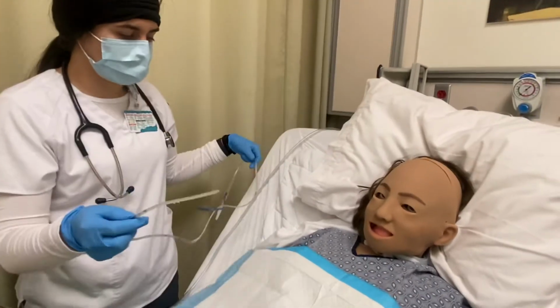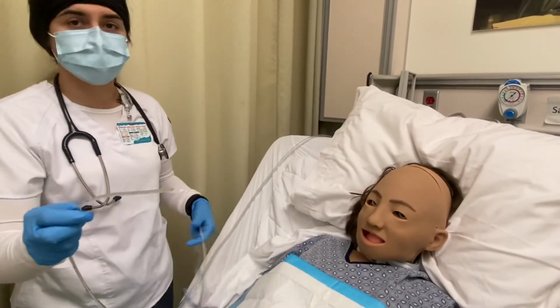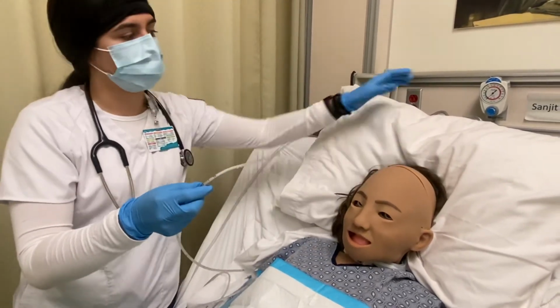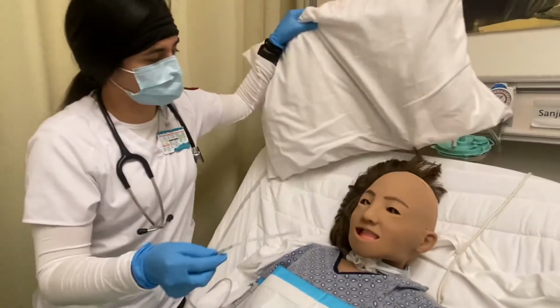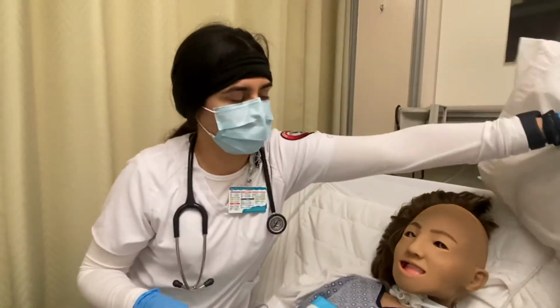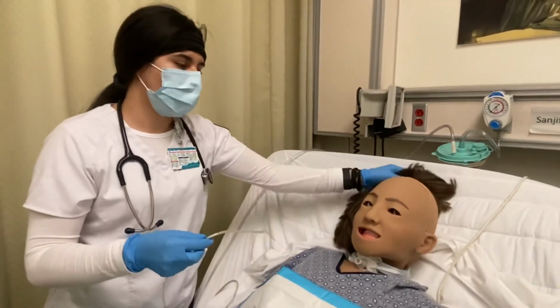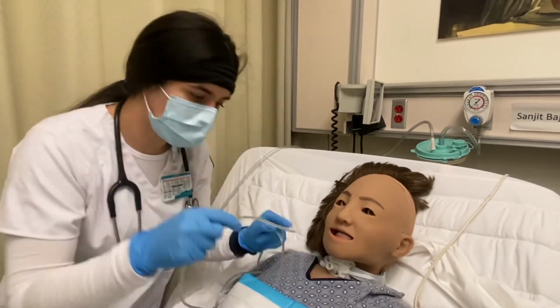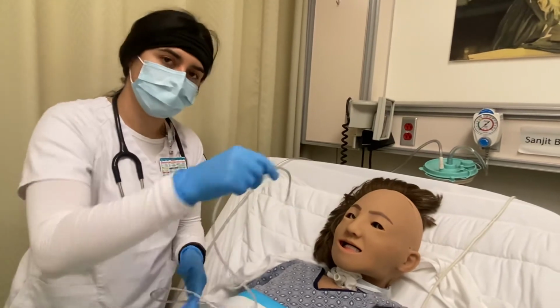Okay, I'm going to tell the patient to extend their neck, so they would put their head back. I'll take this off just to make it easier. They would extend their neck, and I would try to bend the tube so it goes straight down.